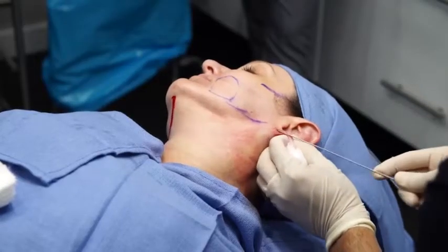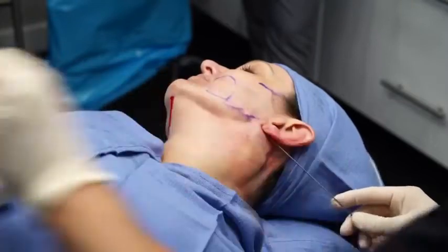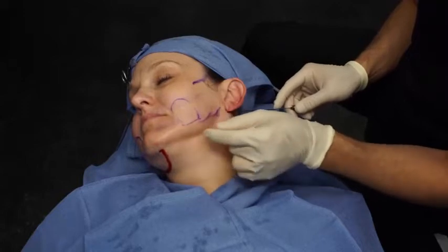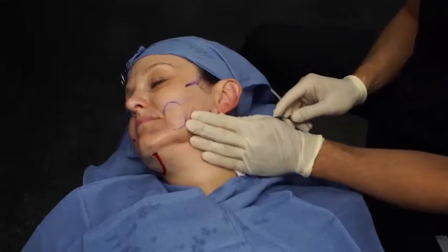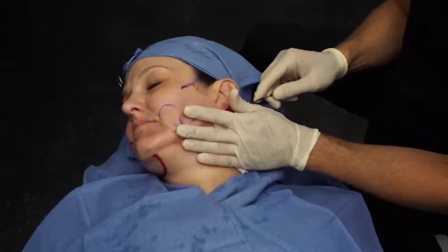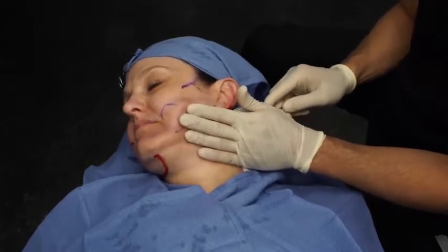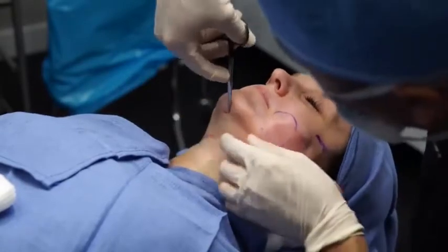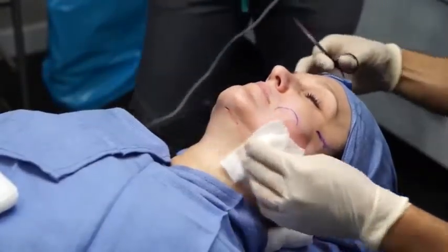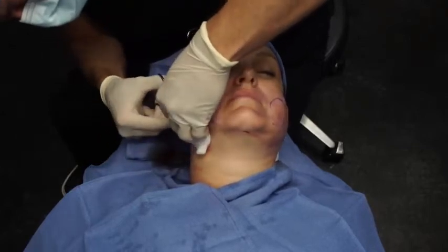Being superficial and knowing your anatomy is the most important thing. We know that the marginal mandibular nerve starts to become superficial right over its path as it crosses over the facial artery. And so basically from here, almost midway from our incision point to the marionette line is where we start to worry about the marginal mandibular nerve. And so we'll tumescent, and the tumescent is actually going to give us a nice safety plane between our treatment zone and the nerve, allowing us to minimize the physical trauma to the nerve. So we'll do 3 ports, and it helps us with access to treat the whole neck, but also, very importantly, helps to promote as much gas egress as possible.